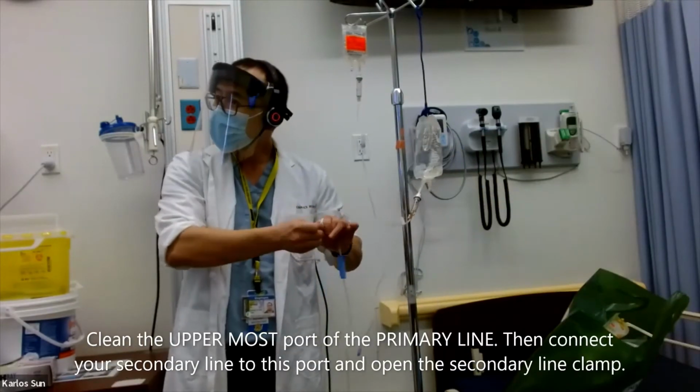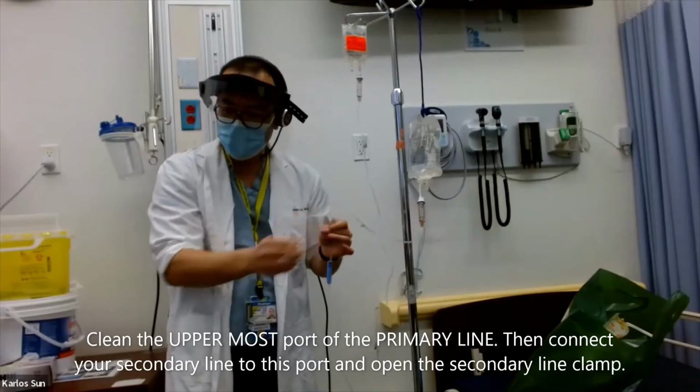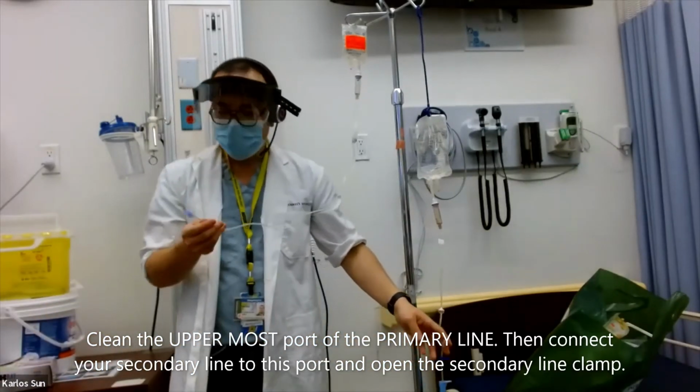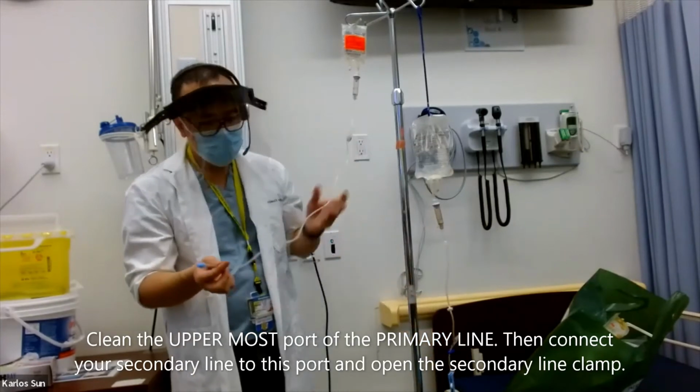Once primed, clean the uppermost port of the primary line. Then connect your secondary line to this port and open the secondary line's clamp.